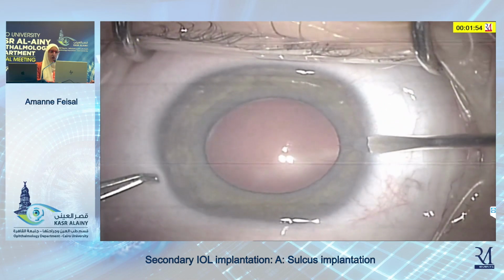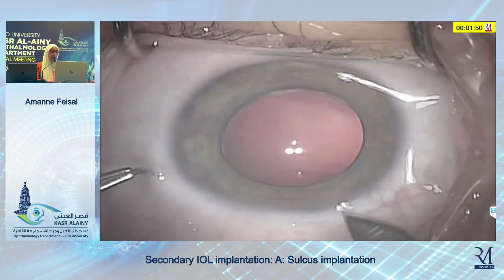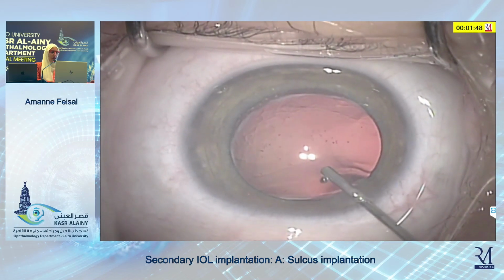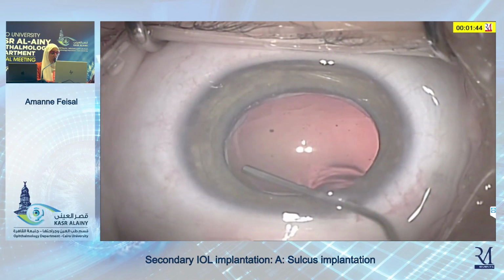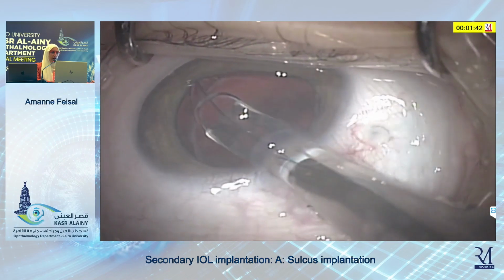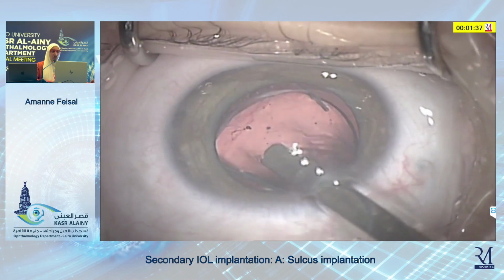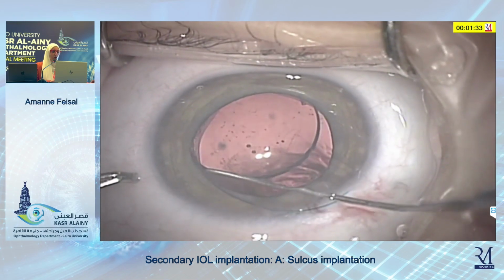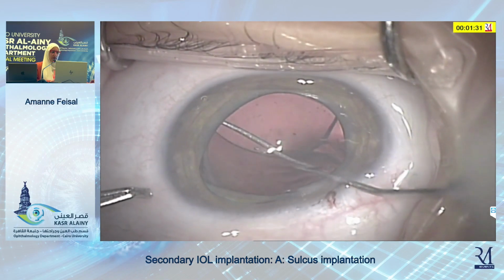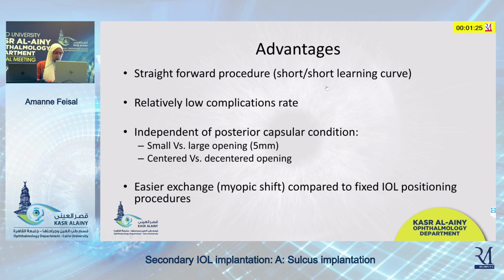The next case is a professor case, which basically uses the same technique. However, the main incision is opened early on. The sulcus, as you see, the capsule is present, actually all around. You find it up at the 12 o'clock position. And again, the IOL is directly injected into the sulcus. And yes, there it goes in. Perfect.